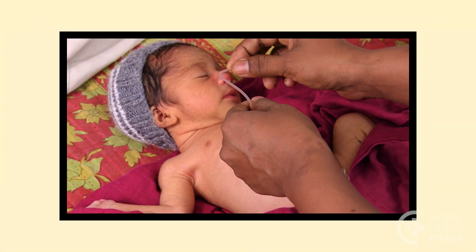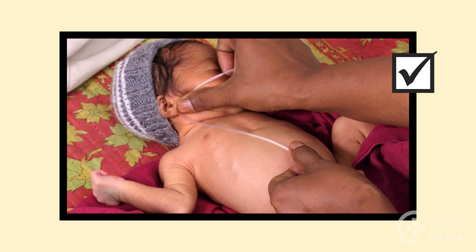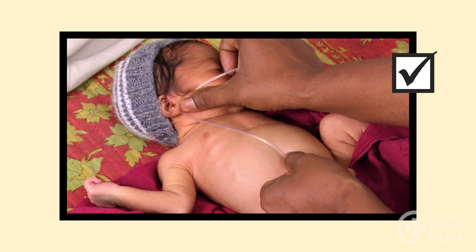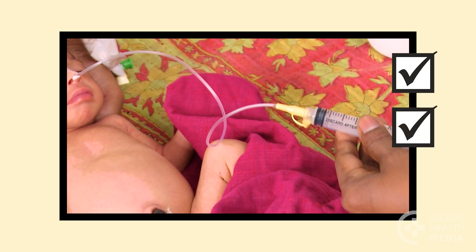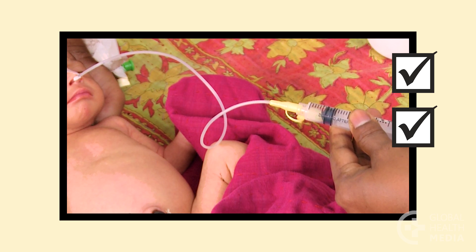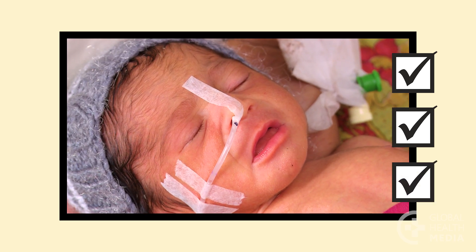Remember: measure the tube from nose to earlobe to a point halfway between the tip of the breastbone and the umbilicus. Confirm placement by pulling back on the syringe to find small amounts of digested milk or gastric fluid. Tape the tube securely, leaving the mark visible near the nose.